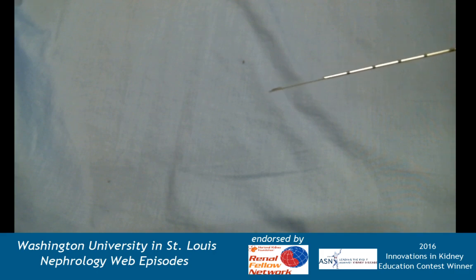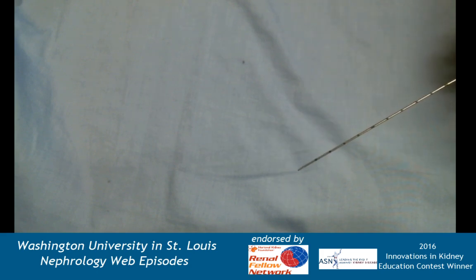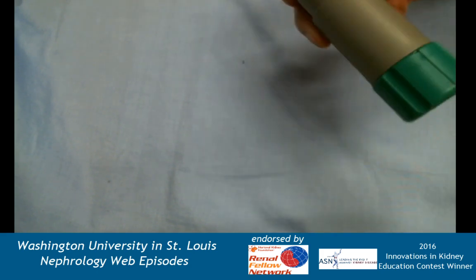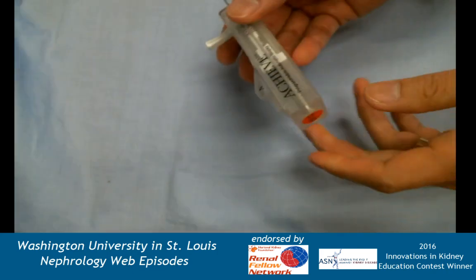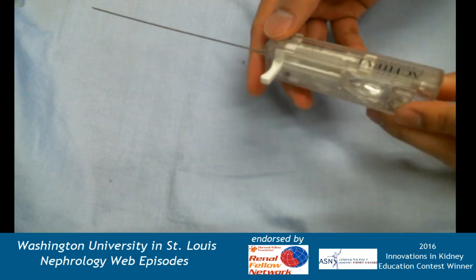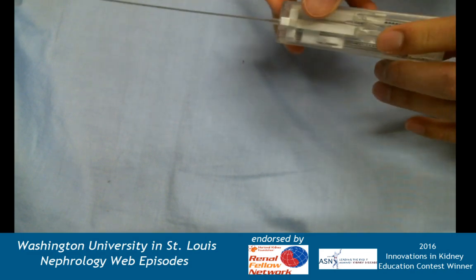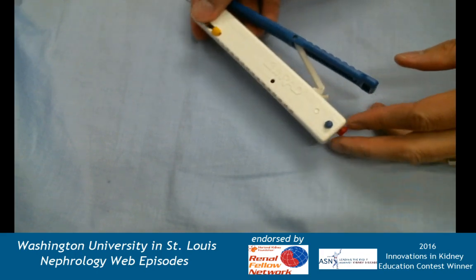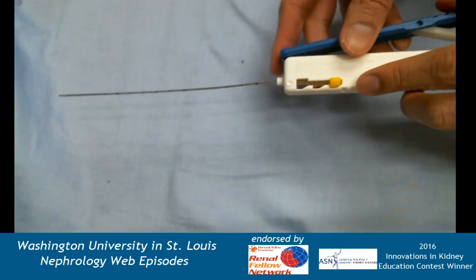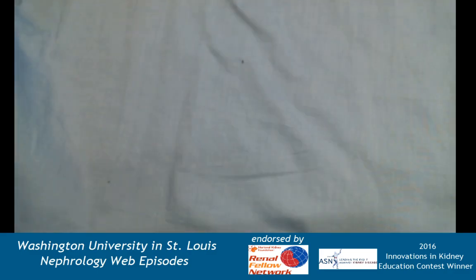When you're ready for your second pass you pull back again and it's cocked and ready to go. There's also another automated biopsy gun — very similar, but instead of twisting you cock it by pulling back, with the trigger on the edge. This one allows you to adjust the depth or the length of the core you want to take.